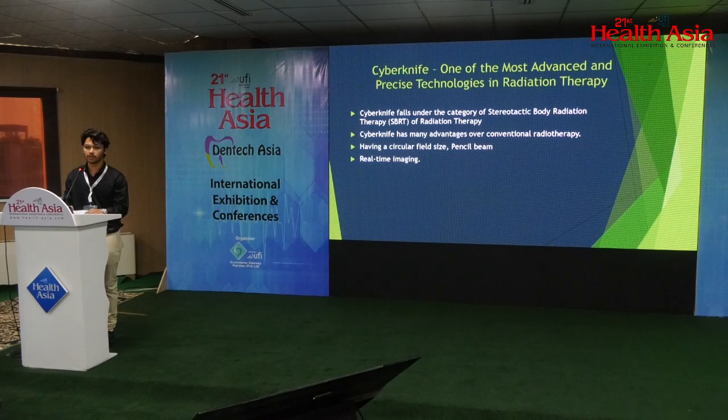Another advancement in Cyberknife, which is not present in older radiotherapy technologies, is that we have real-time X-ray imaging. Usually conventional radiotherapy doesn't have any type of imaging. We only rely on anatomical landmarks and tattooing to position the patient. In Cyberknife, we don't need any anatomical landmarks for accurate positioning. We have real-time X-ray imaging.